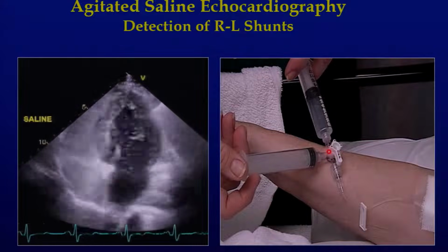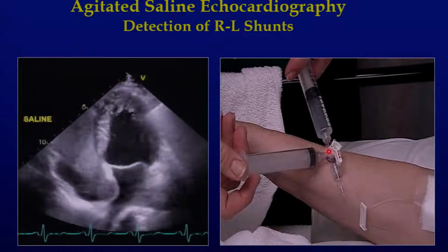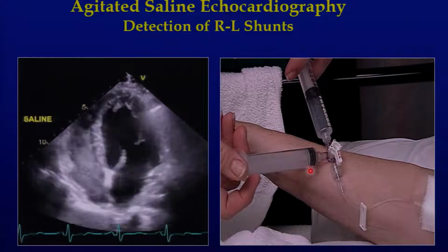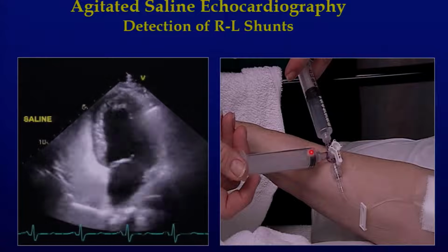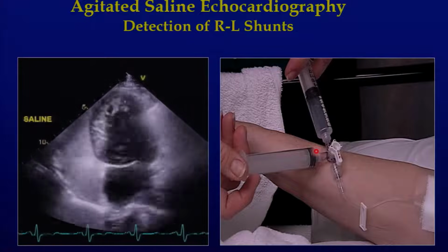And these microbubbles are larger than with the developed ultrasound enhancing agents. They are usually about 10 microns or so. The interesting thing is they don't last too long, and they're large enough that they're caught up by the pulmonary circulation, so ideally you shouldn't see any contrast going to the left side, be it intracardiac or intrapulmonary.